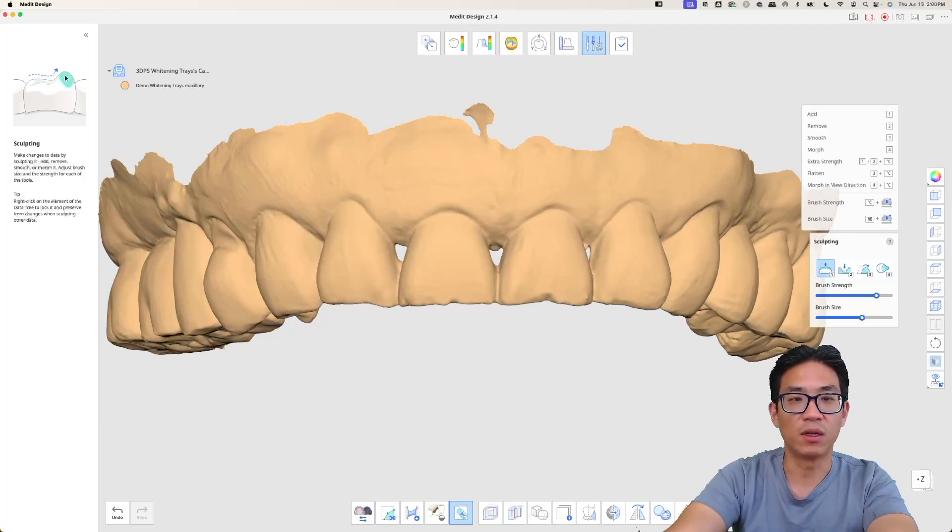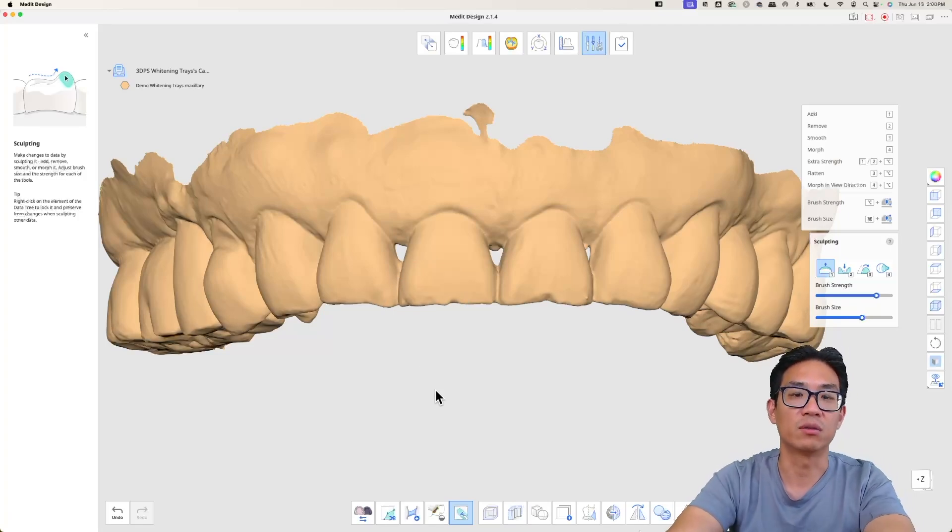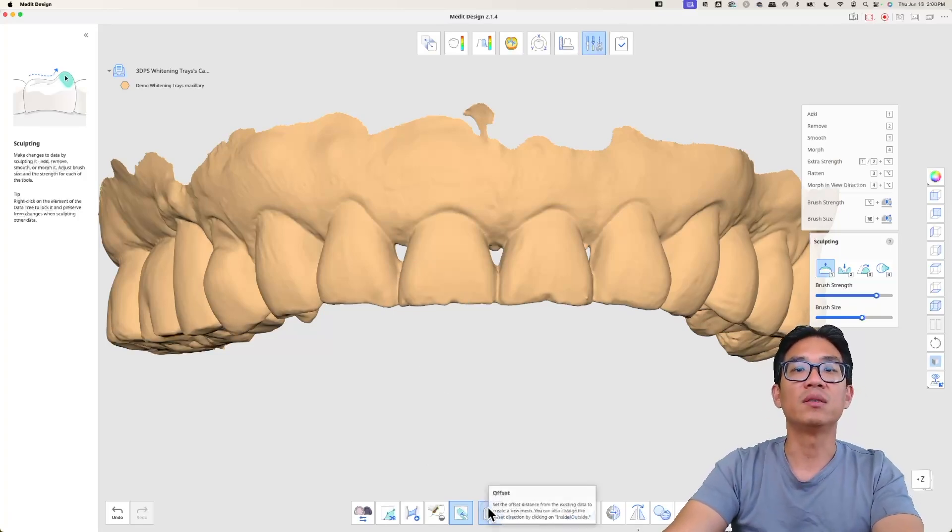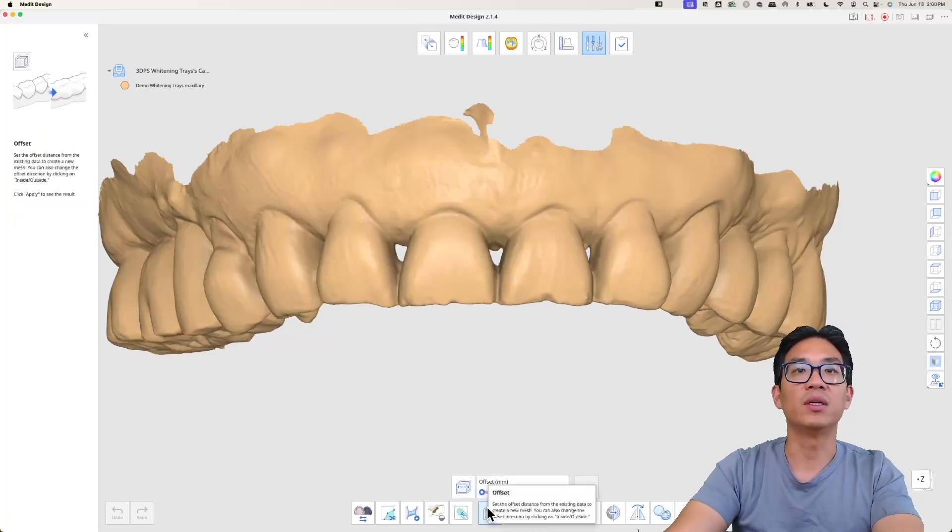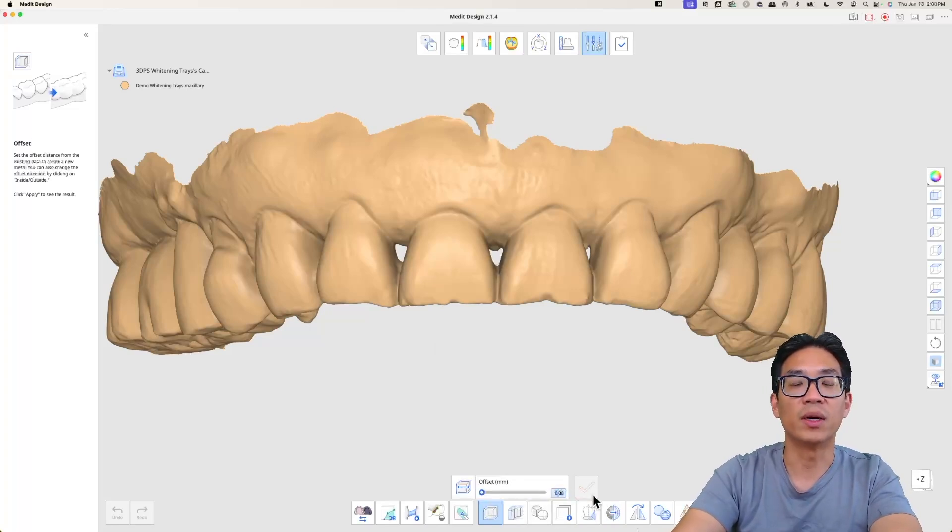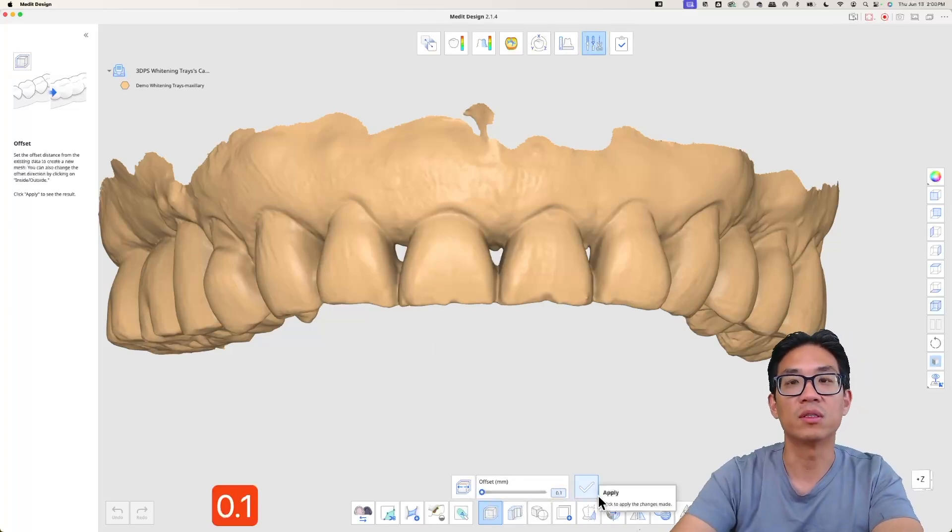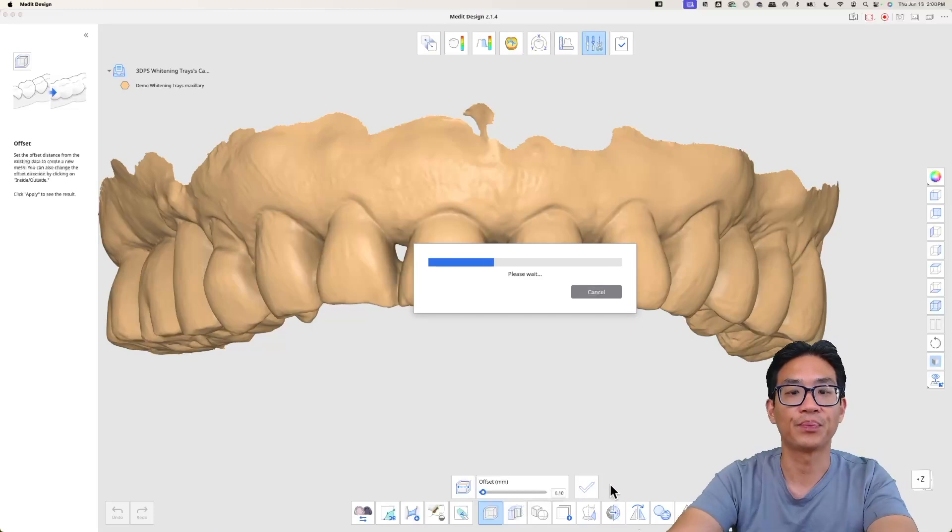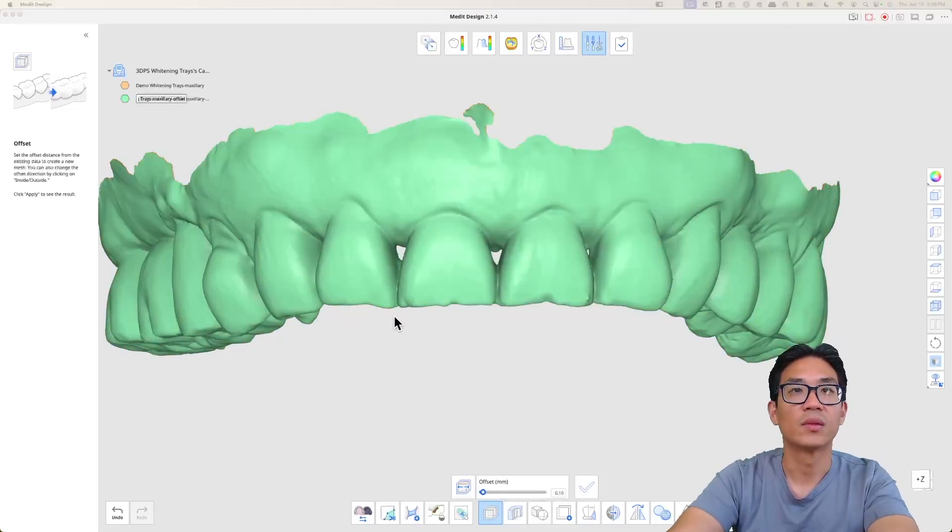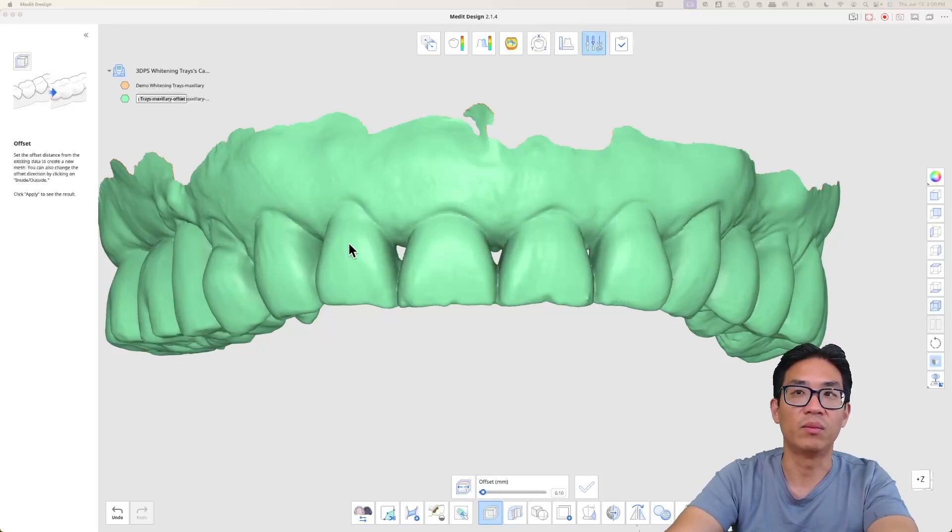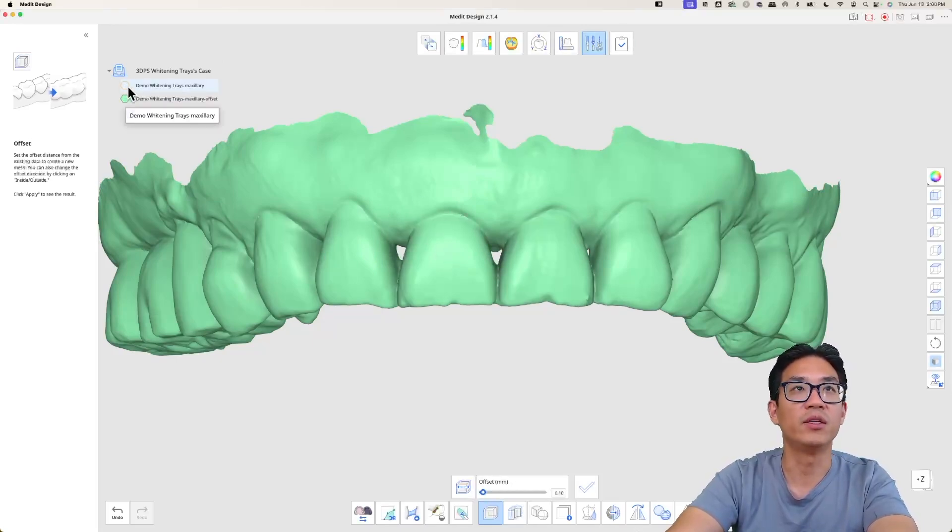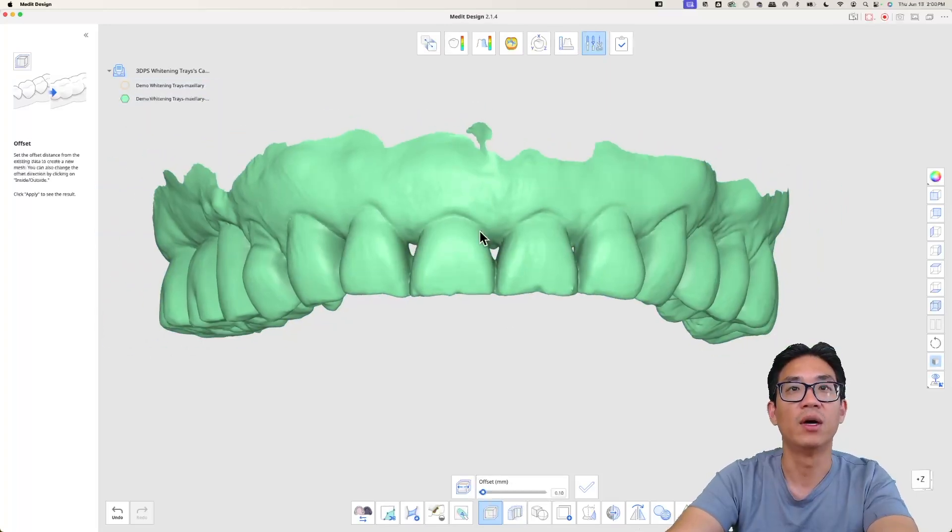Moving along my Google Doc, I want to now offset the model, so basically just hit this button here and I want to offset the model by 0.1 millimeters, so just hit 0.1 and hit apply. That just made a model that's 0.1 millimeters bigger. I'm gonna hide the original orange model and then we're working with this green model here now.